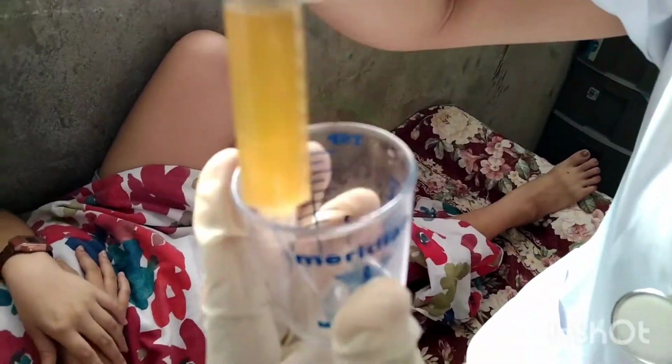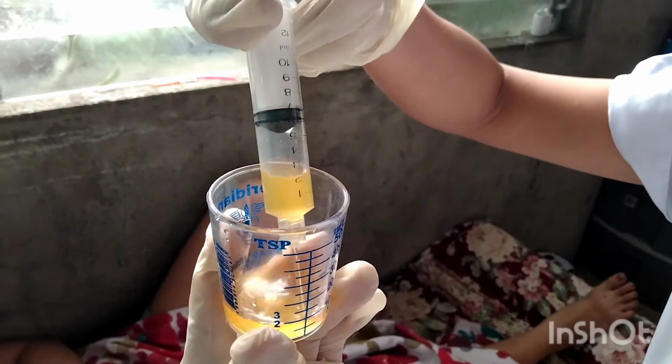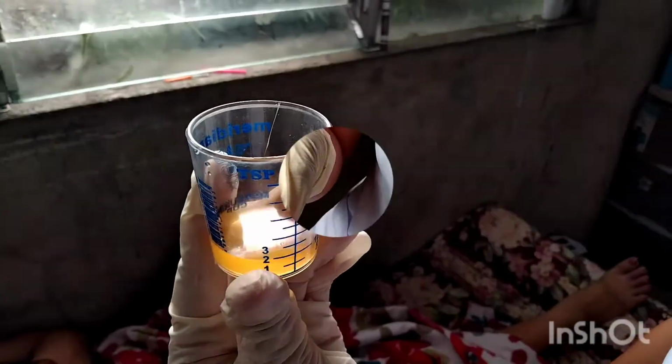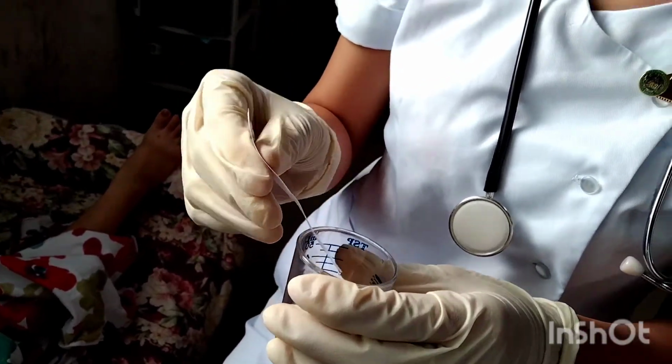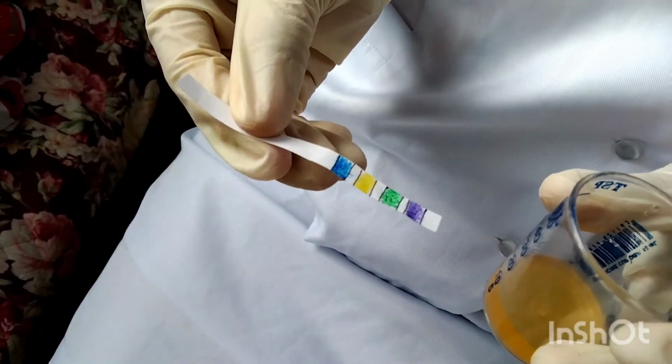Next, measure pH of aspirated gastrointestinal contents. Fasting gastric pH is usually equal to or less than 4. It is only infrequently greater than 6. In contrast, intestinal aspirates usually have a pH equal to or greater than 7.